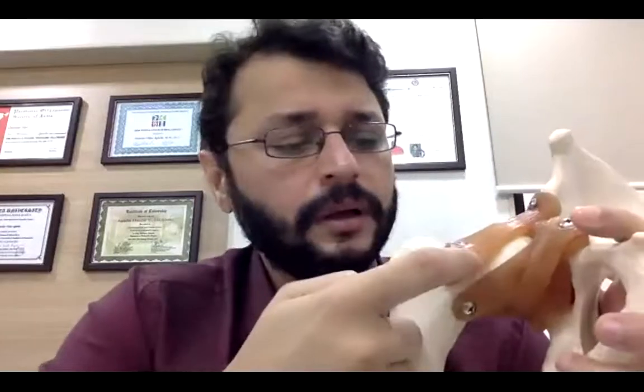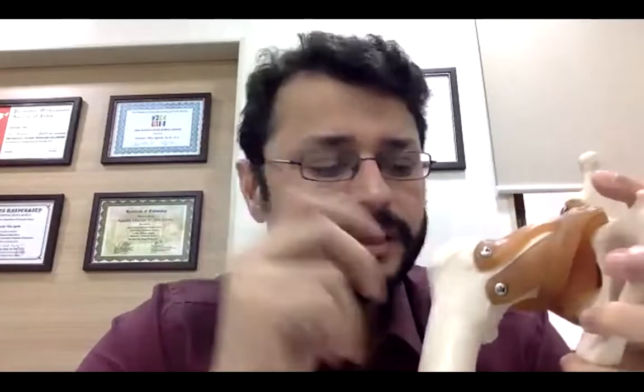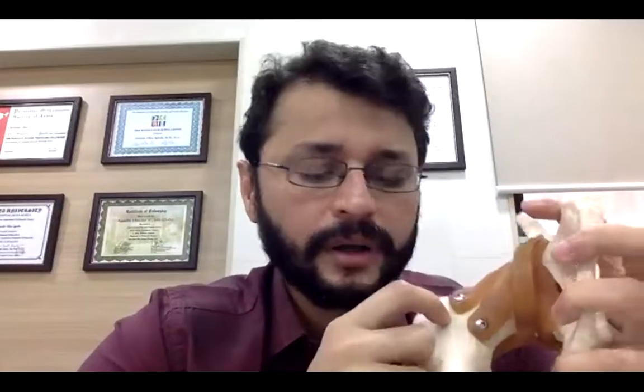So what I have started doing is something in between what Prasad describes and the conventional method. There is something known as a universal entry point. This is the model of the hip, and this is the intertrochanteric line. If we have a slip which is posterior, conventionally the entry would have been right anterior here, which was intracapsular. As against that, the entry which Prasad describes is just on the border between the lateral and the anterior surface of the hip, somewhere here. What has been described as the universal entry point is somewhere in between, just lateral to the intertrochanteric line, and it then goes obliquely. Now this has a very, very slight chance of having a posterior breach.